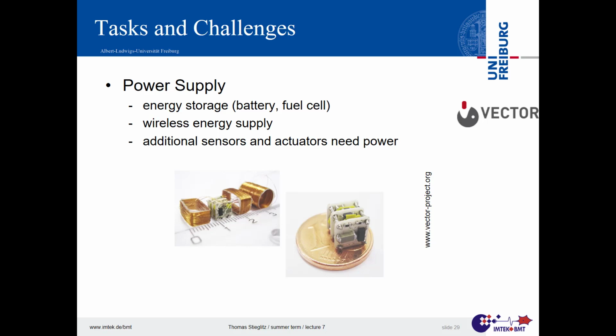So making devices small, if you want to have triangulation, you can have a lot of coils outside, or if you don't want to have those 8 or even more coils outside, you'd say, well, can't we do that? That we have internally 3 coils, 1 for each direction in a Cartesian coordinate system, shown here, Z, X, Y direction, for example, and can't we get the information out over those coils? On the other hand, if you want inductive powering, it's always good to have the maximum power out of the electromagnetic field, and if the field comes from one direction and your coil is not perfectly aligned with a cross-sectional area in that direction, you don't get so much energy out of the field. If you have 3 coils in 3 directions, no matter where the field comes from, you could harvest much more.